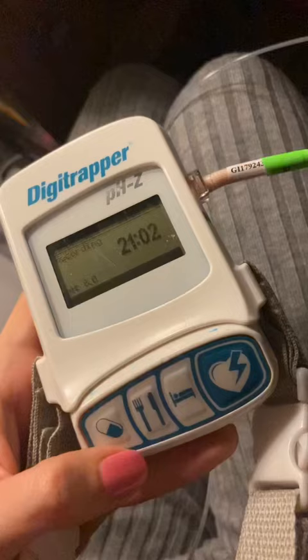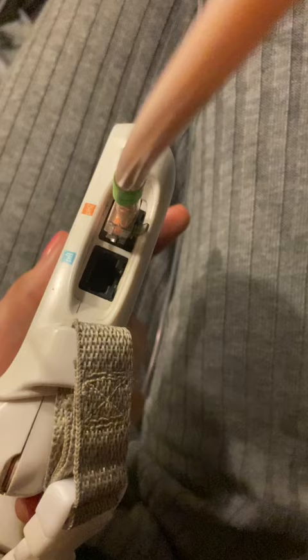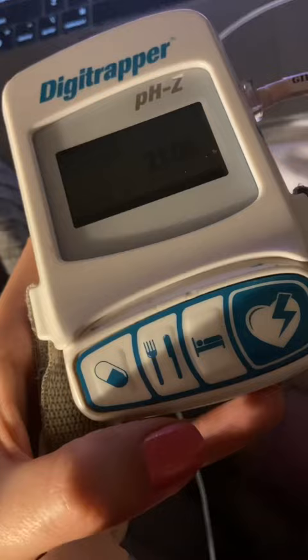Then they tied another tube to me all the way to my stomach. I get a machine where I have to track my symptoms, and it captures the data. For example, here I'm entering that it's time to eat.